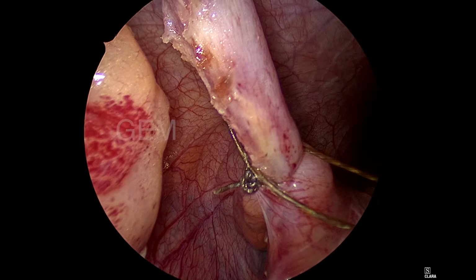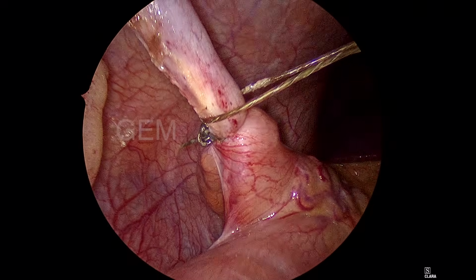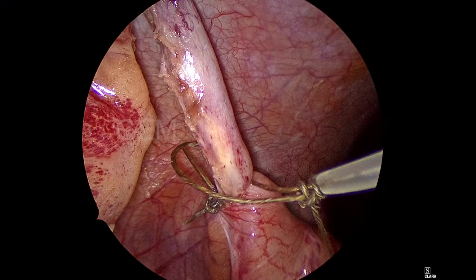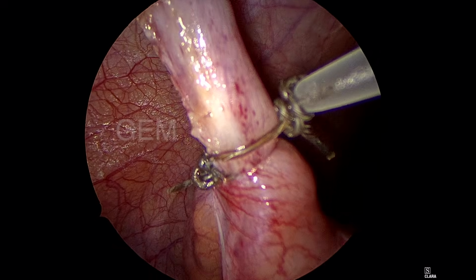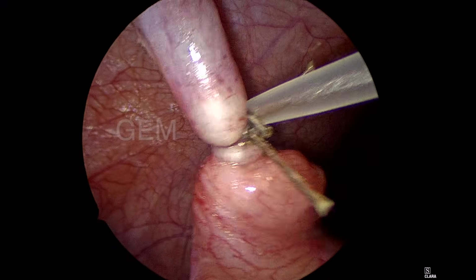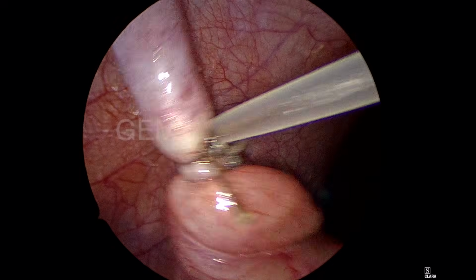So this is not a good technique, applying the loop. I told you yesterday, in the last video, that the thread should not touch the appendix when you tighten the loop. And so now you can see I apply the second loop at around a 2 mm gap between the two loops. The second loop you can tighten very nicely.